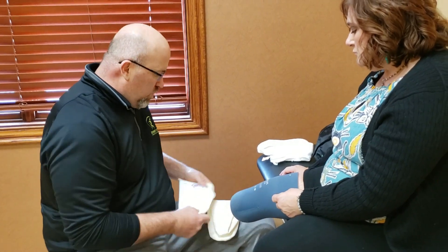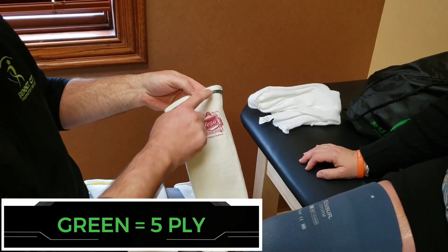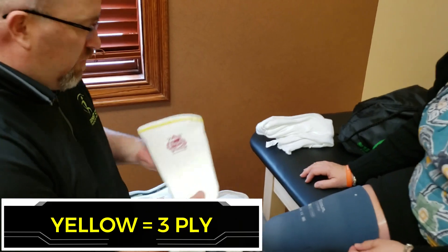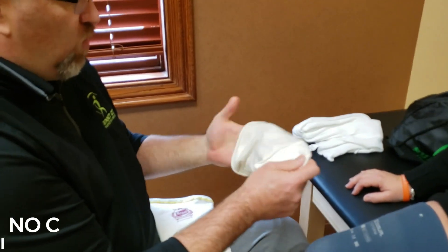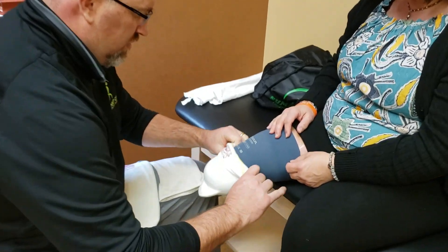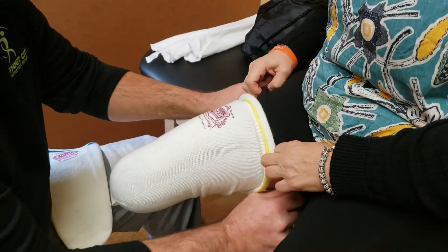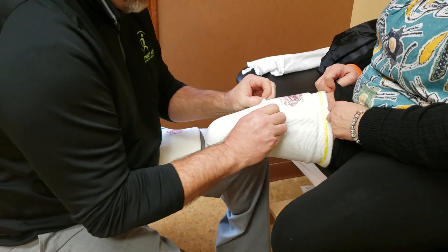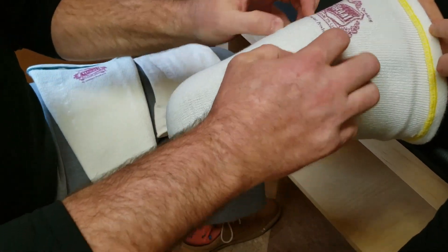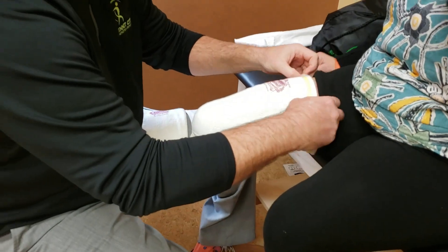We'll spend the next several hours of use in the prosthesis on a trend of shrinking — typically the more steps we take, the more we shrink. We dispense a couple different thicknesses of socks. The thickest is a five-ply, indicated by a green band. The middle of the road is a three-ply, indicated by a yellow band. And a filler or maintenance sock is a one-ply. To put the sock on, it's a little like that first layer of the shrinker — just pull it up. We don't want to stretch it really taut because that opens up the fibers and effectively turns a three-ply into a two or one by longitudinally stretching it upward on the limb.